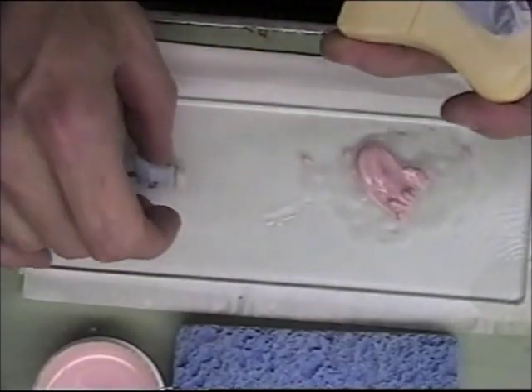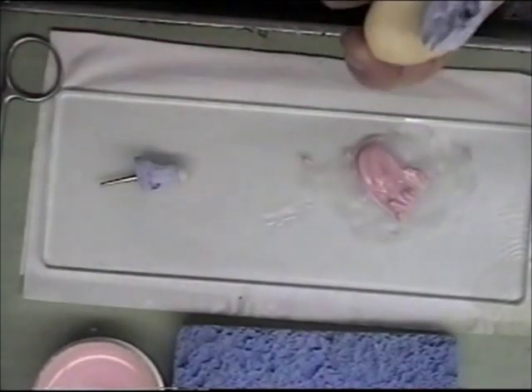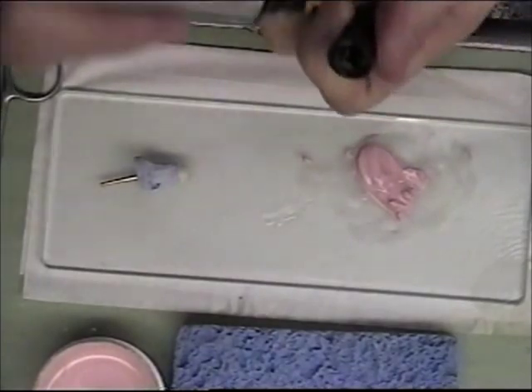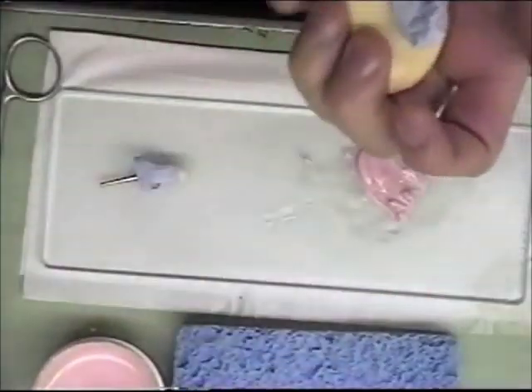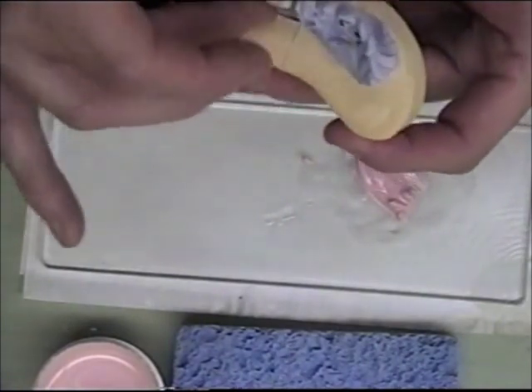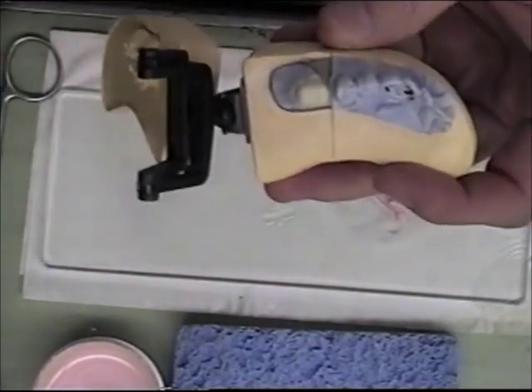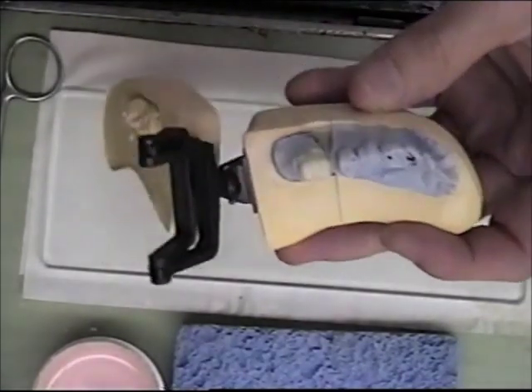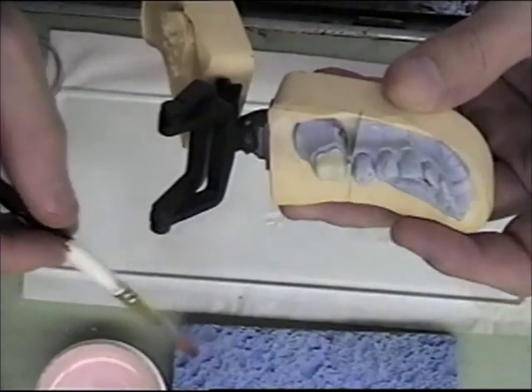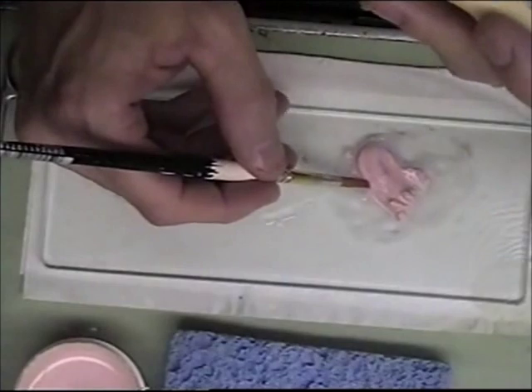I'm going to put a little sealer separator on the contact area of the adjacent tooth so that the porcelain does not stick to the model. I will use a brush for this buildup.